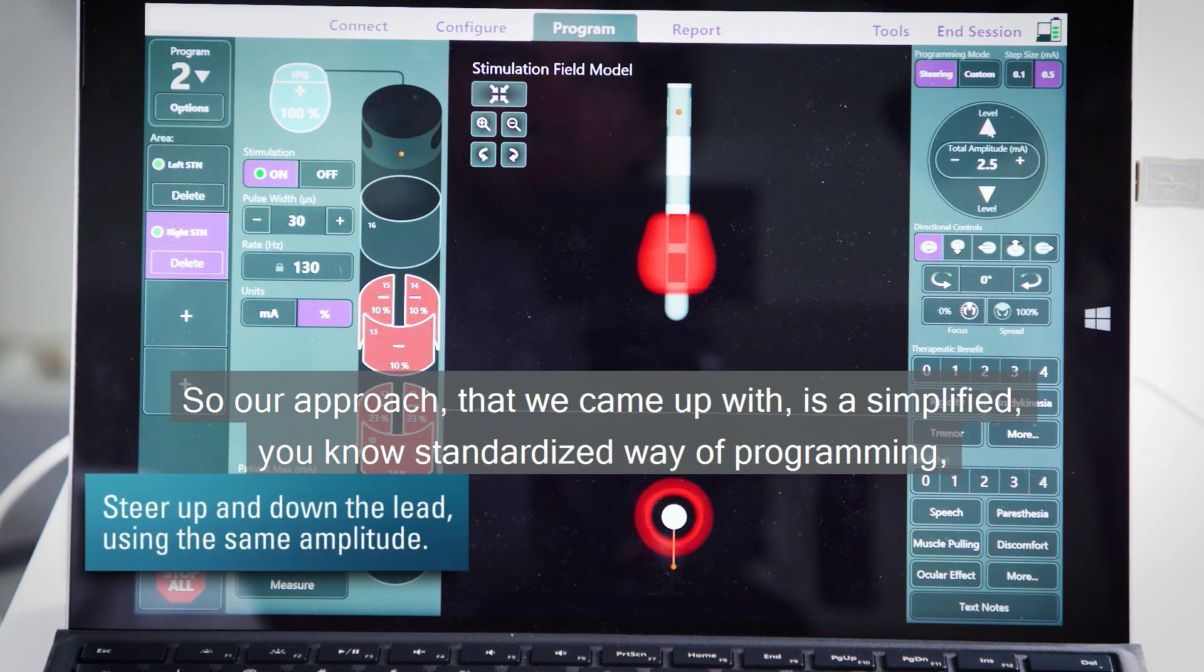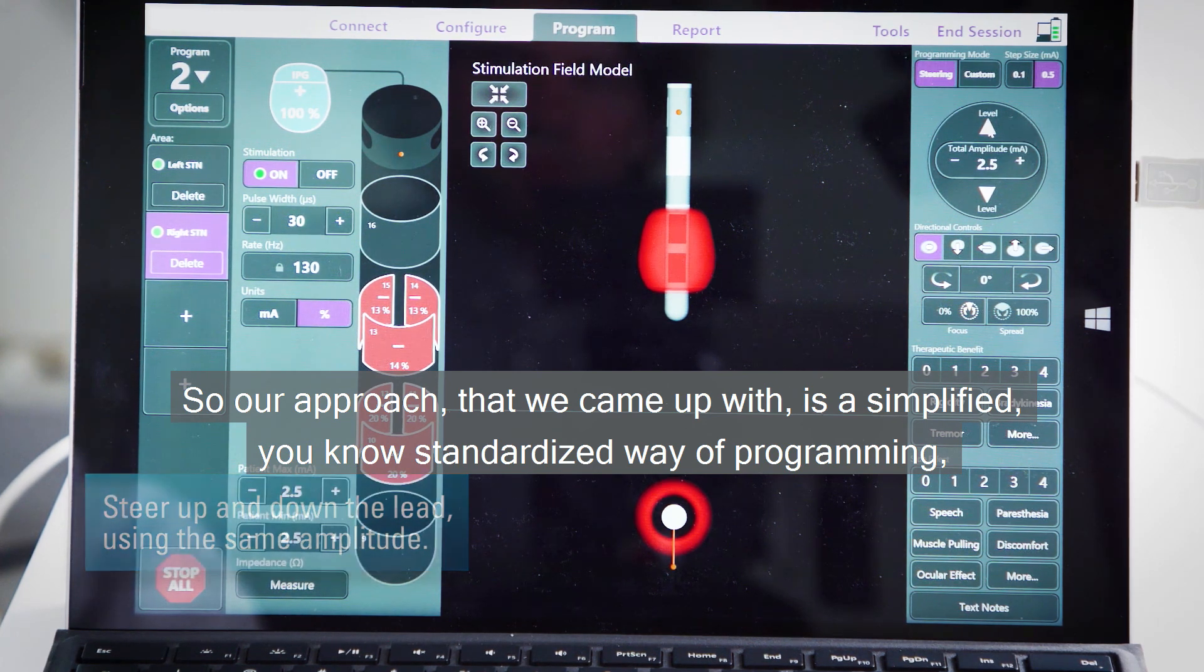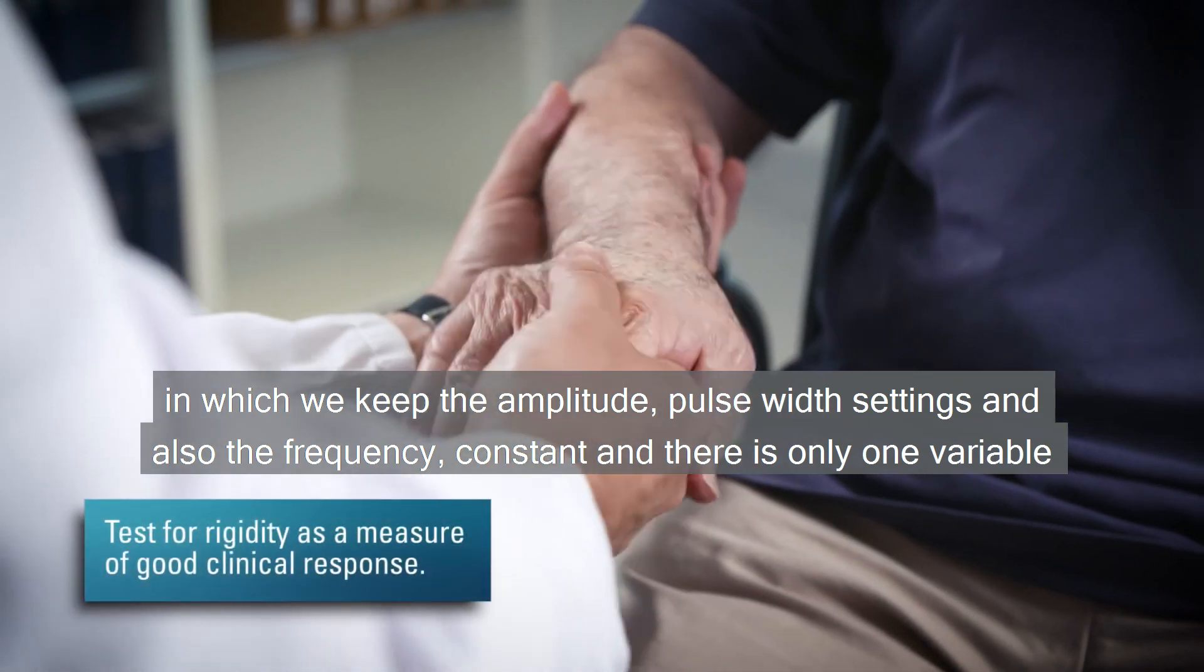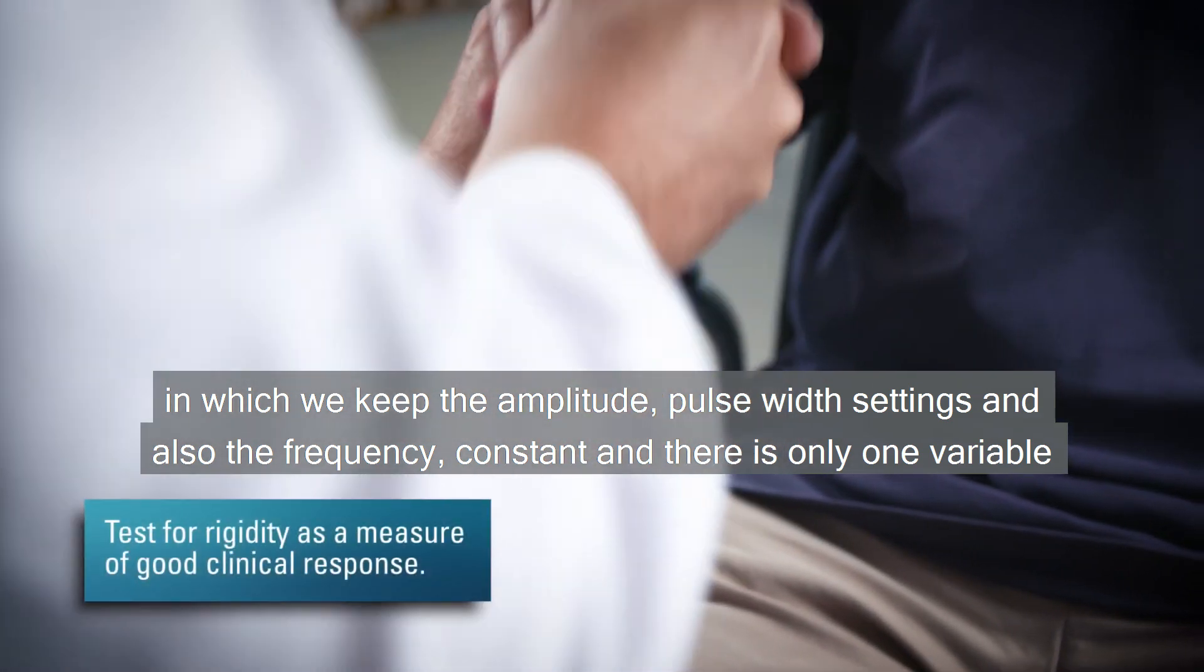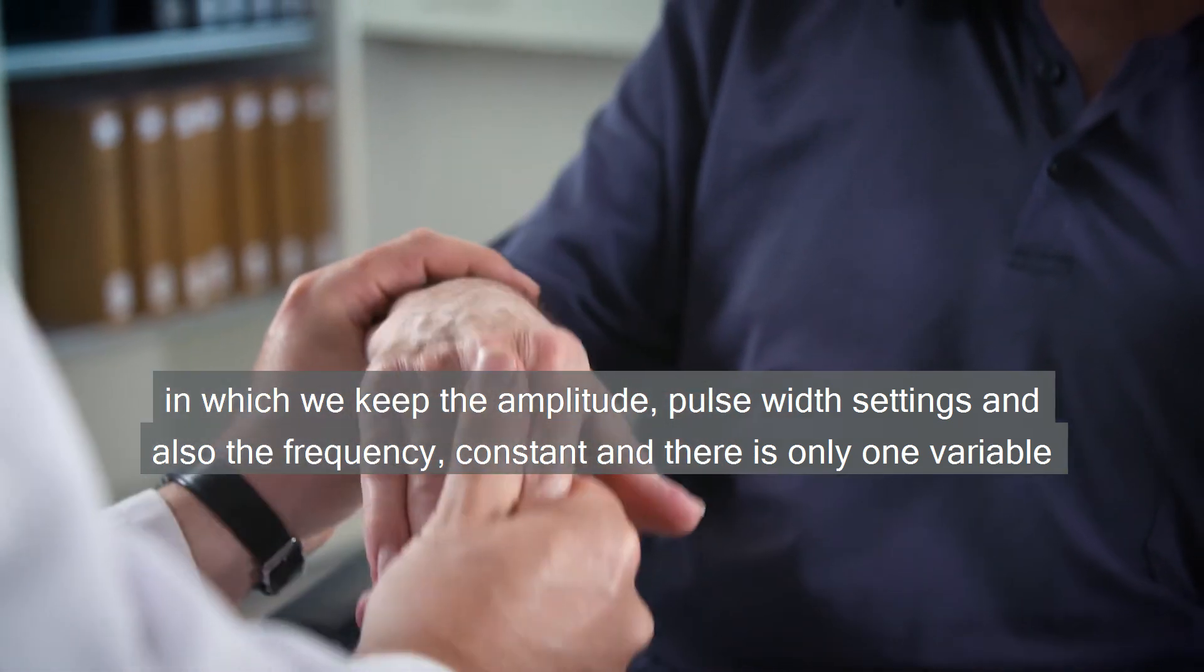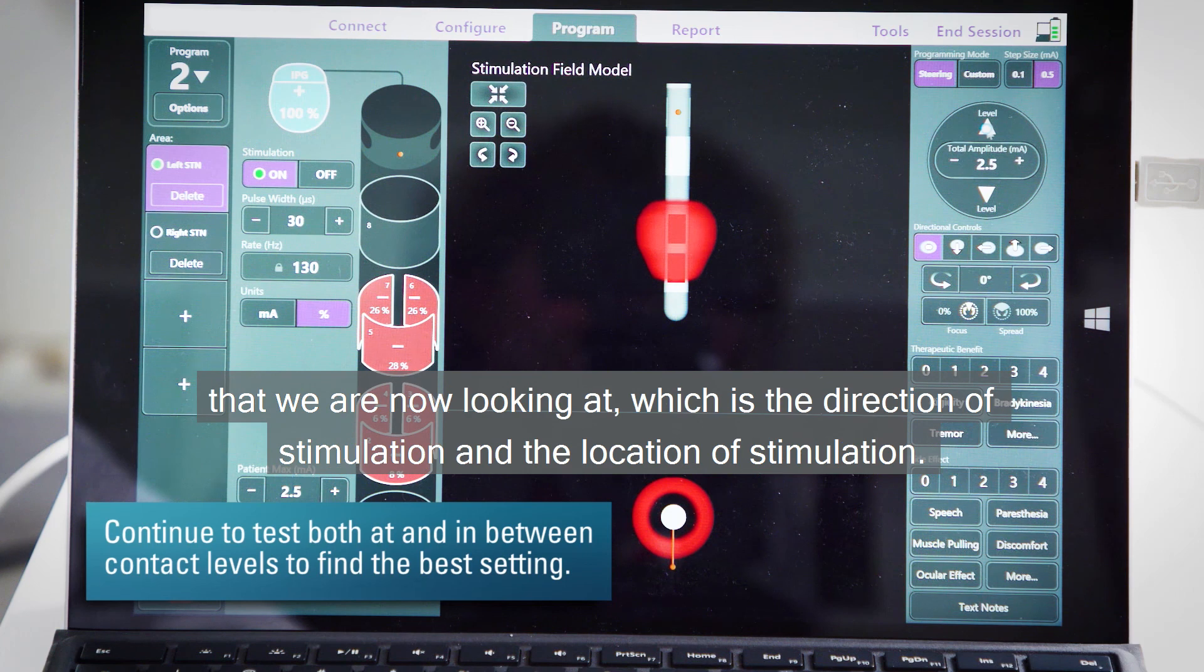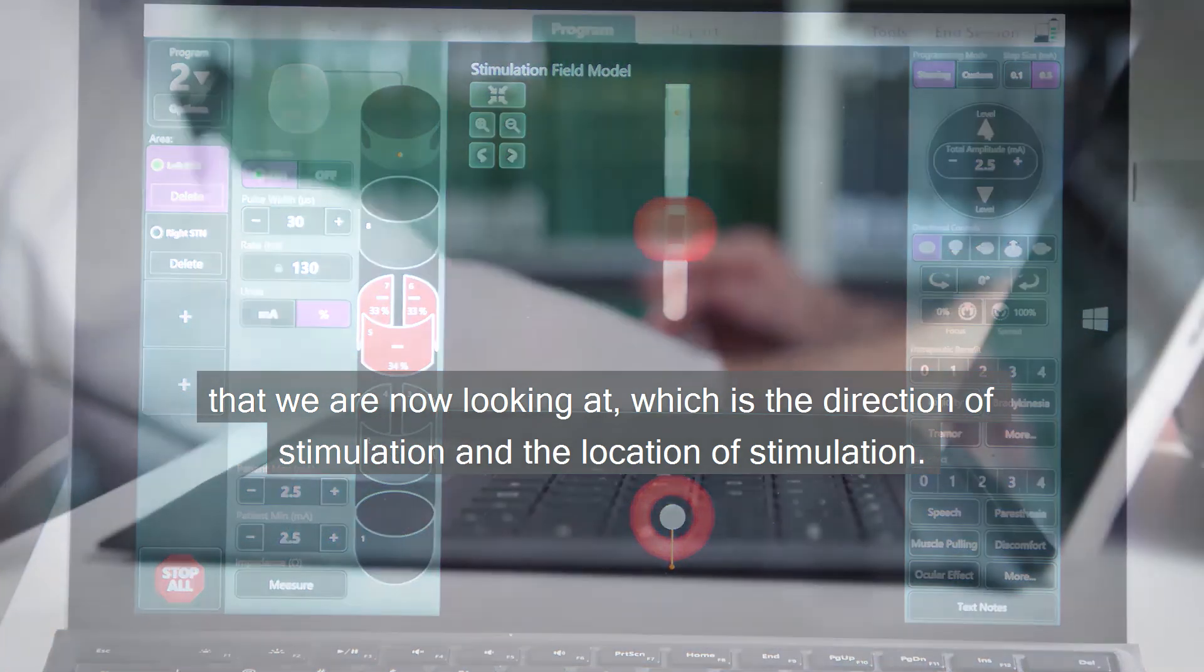So our approach that we came up with is a simplified, standardized way of programming in which we keep the amplitude, pulse width settings, and also the frequency constant. And there is only one variable that we are now looking at, which is the direction of stimulation and the location of stimulation.